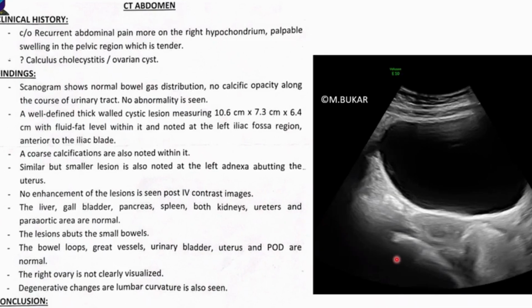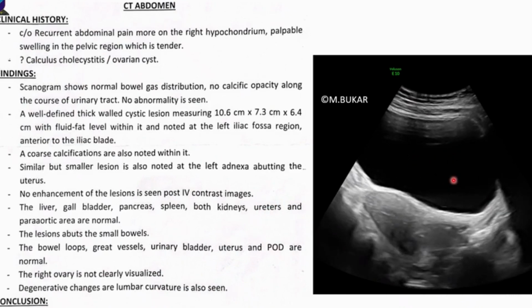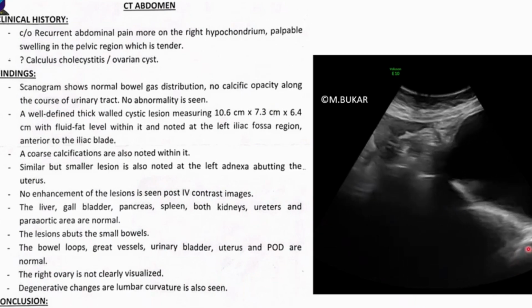Now, when I did the ultrasound scan, after having wasted her resources on a CT scan, note this full bladder or overdistended bladder, making the uterus axial in nature, and look at the lesion here.